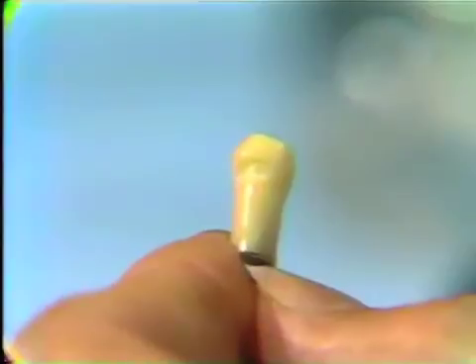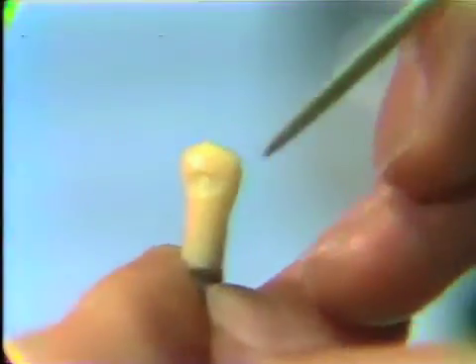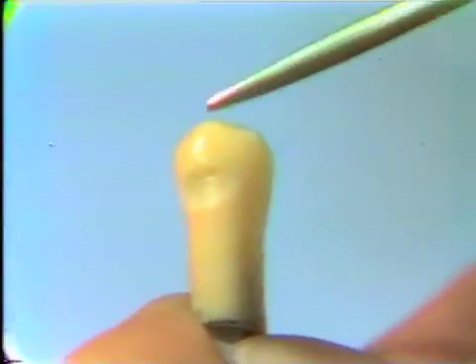The next tooth that we're going to wax is the lower left first bicuspid cuspid, and we're going to wax in a class 5 or cervical restoration. The thing we have to remember is to follow the contour of the tooth both from an occlusal-cervical direction and a mesial-distal direction.